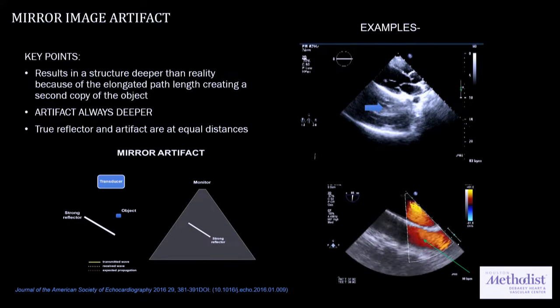No signal? That's what I hear. But you know what? You're going to have a signal. You'll have the same signal. Why do you think you're seeing color Doppler? That's Doppler, right? So you will see the same thing. And this is a beautiful example.